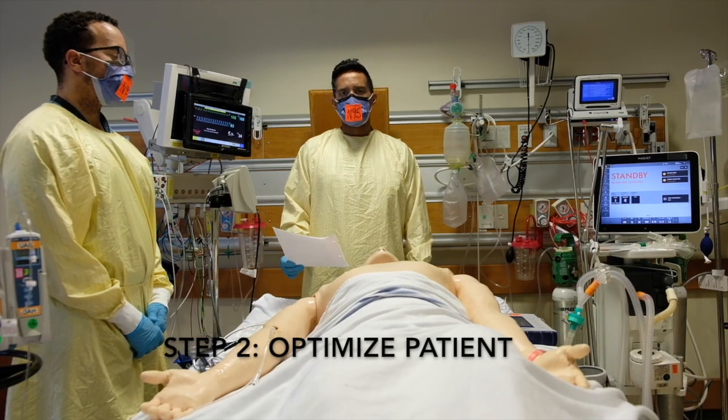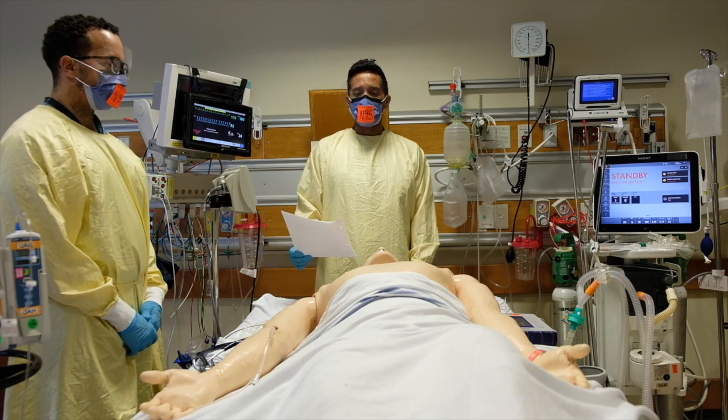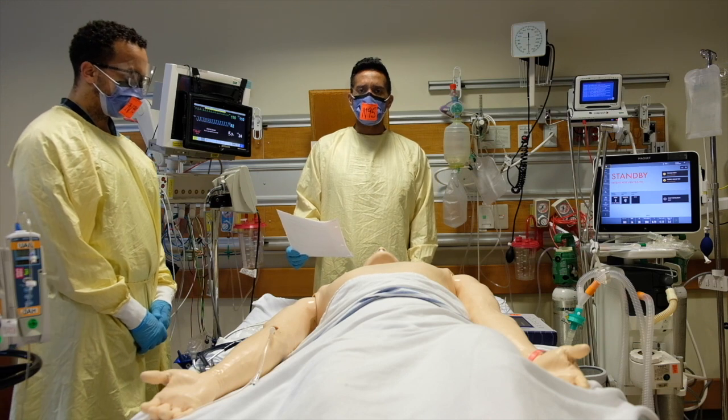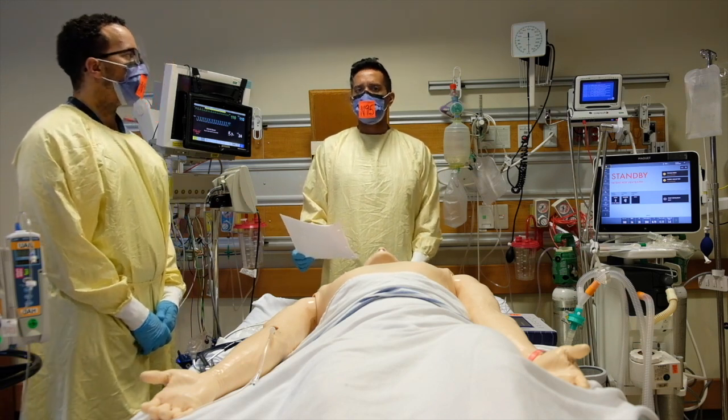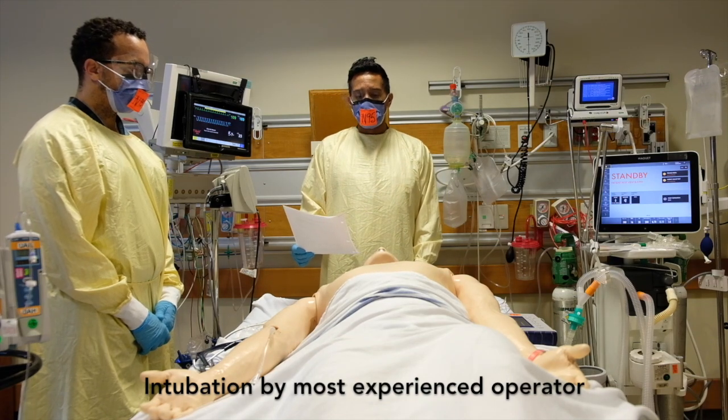So the second step is to ensure that the patient is optimized by the checklist. I've already completed the airway exam. There are no difficult airway characteristics, but if there were, we would consider getting anesthesia involved. And specifically for COVID-19 patients, we should always have the most skilled operator do the first attempt.